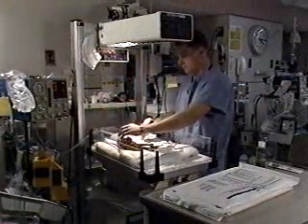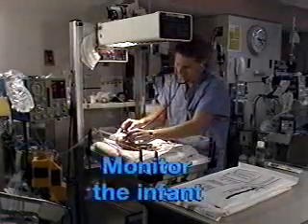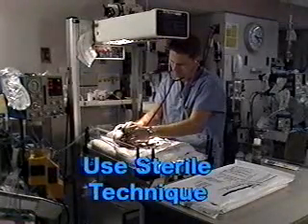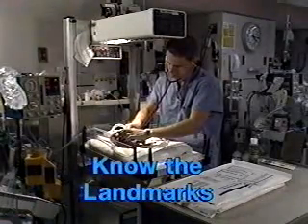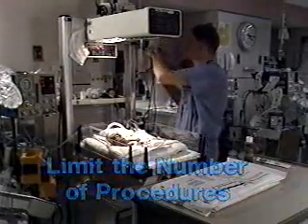Performing a successful lumbar puncture procedure is ensured if the practitioner and assistant follow the guidelines we have seen, accurately evaluating and continuously monitoring the infant's clinical status, consistently using a strict sterile technique, knowing the landmarks to determine the best puncture site, and limiting the number of punctures and sticks for each patient.